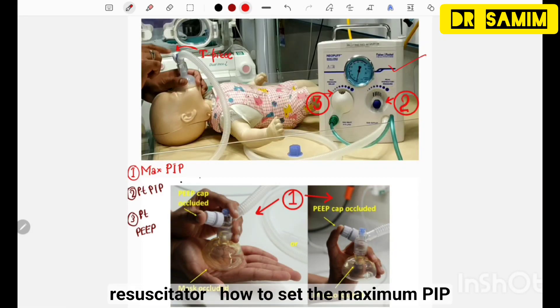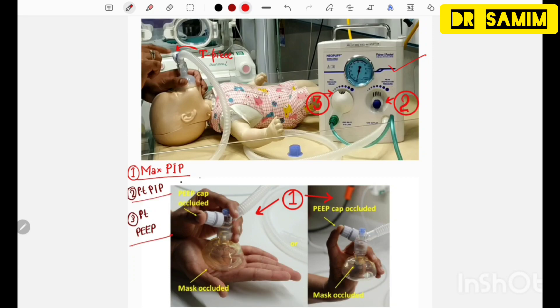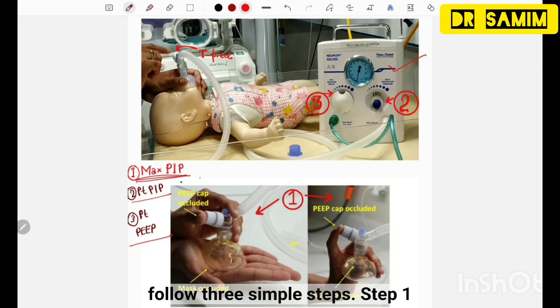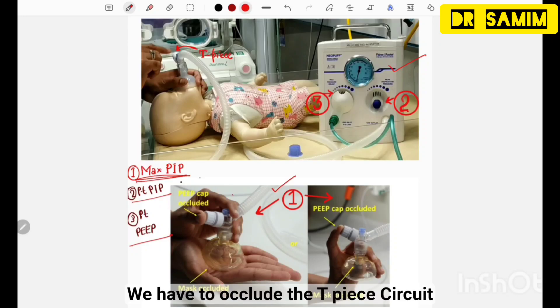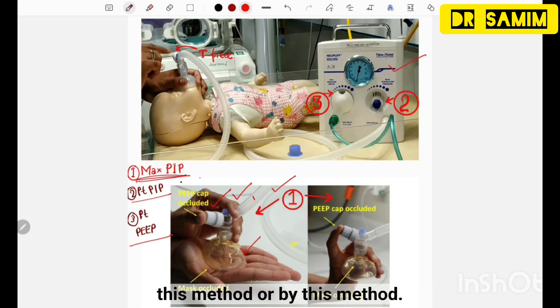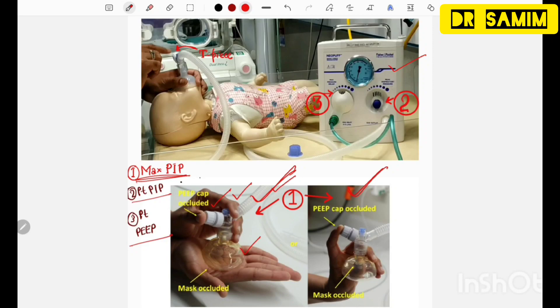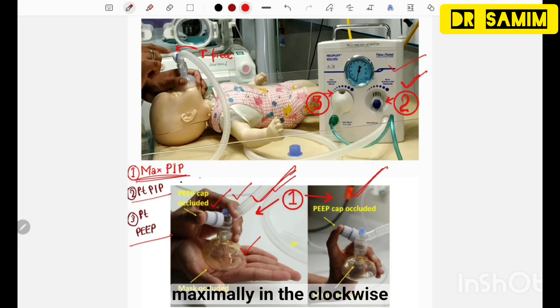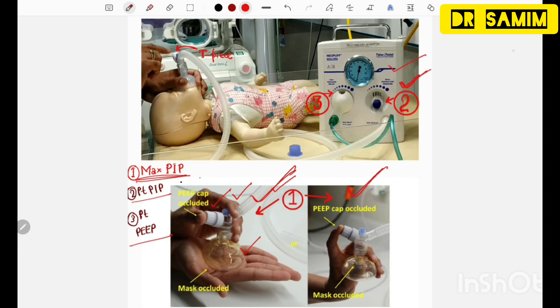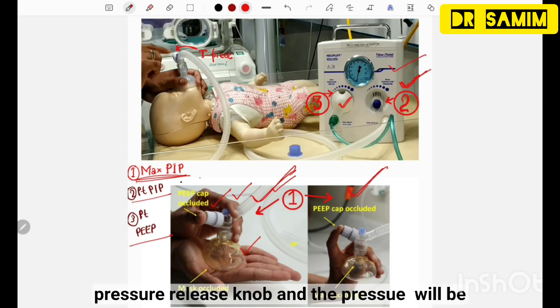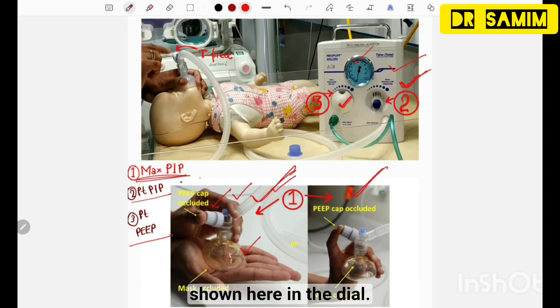Now we will learn how to set the maximum PIP, patient PIP, and patient PEEP in the T-piece resuscitator. To set the maximum PIP, follow three simple steps. Step 1: occlude the T-piece circuit by occluding the PEEP cap and the outlet by either method shown. Step 2: rotate the PIP control knob maximally in the clockwise direction. Step 3: adjust the maximum PIP by rotating the pressure release knob, which will be shown on the dial.